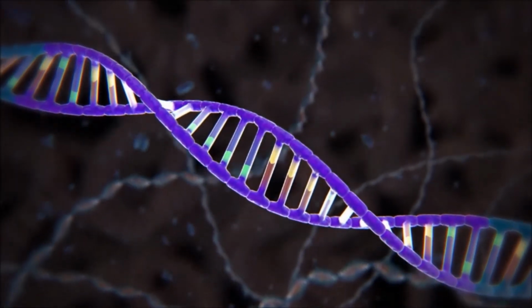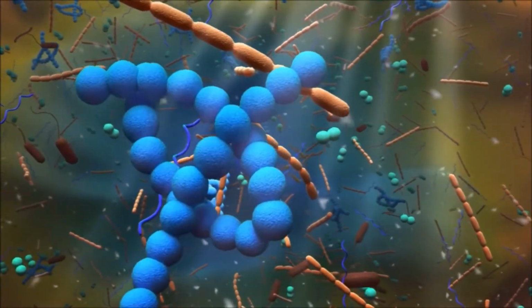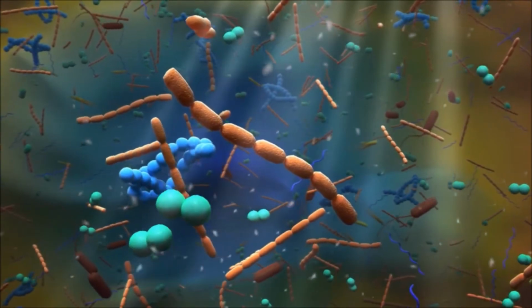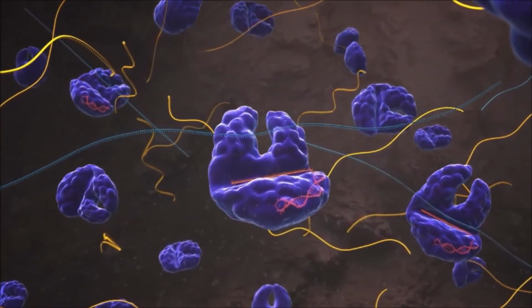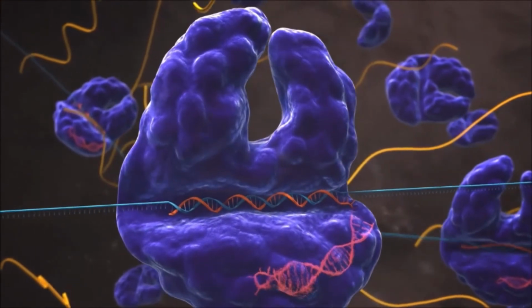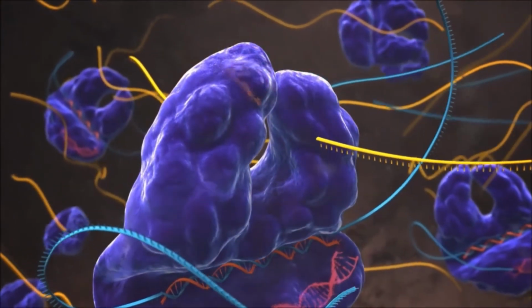to treat human disease. But Cas9 isn't the only CRISPR tool with applications for human health. A team of scientists found that a cousin of Cas9 called Cas13 can be harnessed to actually detect human disease. Here's how Cas13 works in its natural environment. First, it hunts for viral RNA using an RNA guide. When it finds its viral target, Cas13 becomes activated. In some circumstances, it cuts any RNA it encounters, a process termed collateral cleavage.